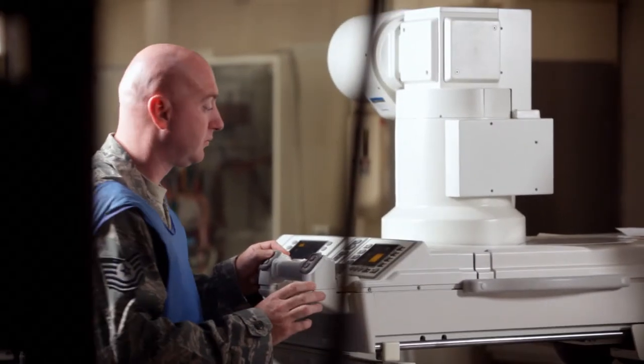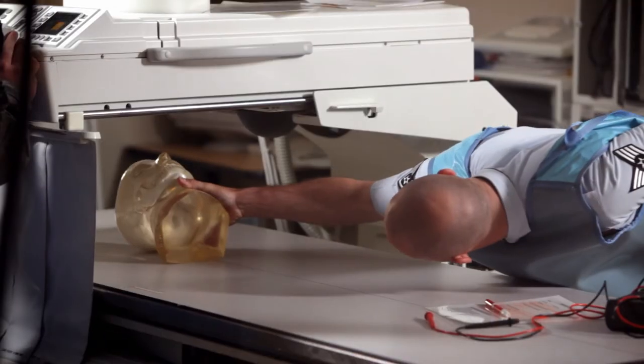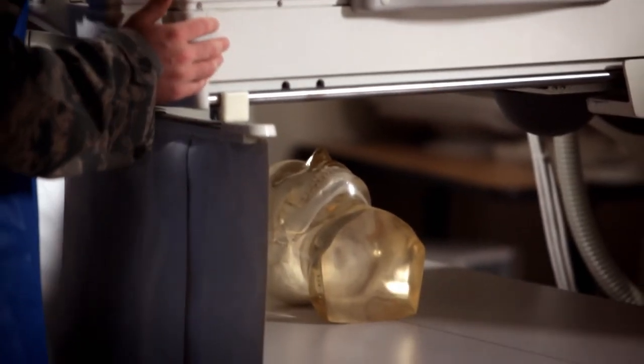At this course we also have to incorporate anatomy and physiology. The biggest reason why is in order for us to troubleshoot something, we need to be able to duplicate the symptom that the operator was doing on the particular patient or the tests that they were running. So we need to know how to operate it and how they were applying that piece of equipment in order to accurately troubleshoot the symptom that occurred.